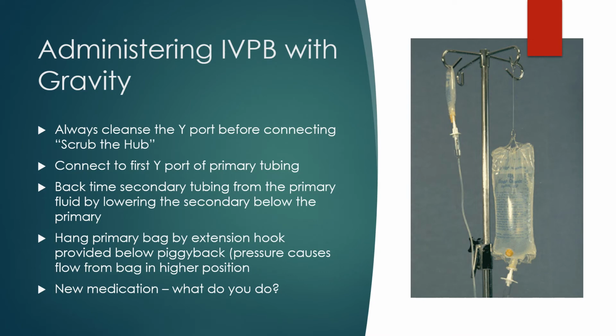This slide just explains how we would administer a secondary via gravity. I'm not going to get too much into this, but I want you to be just aware of that this is also a process.